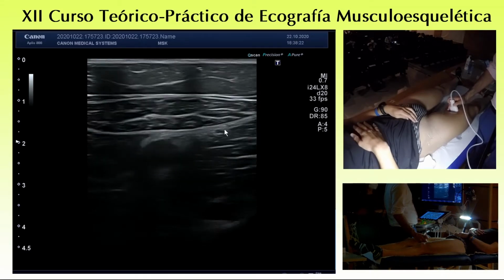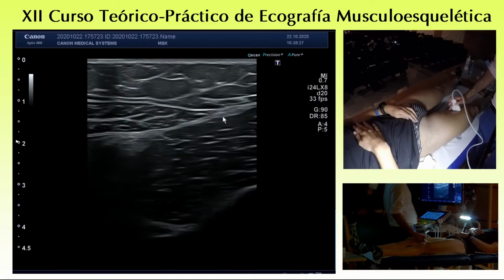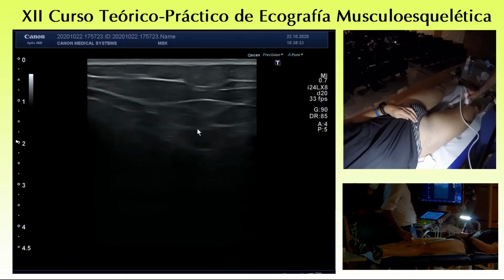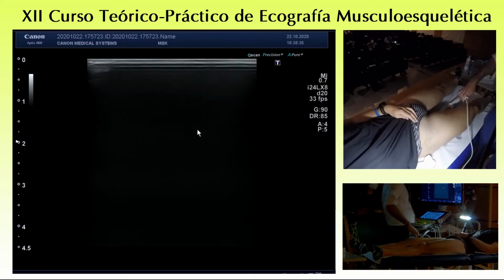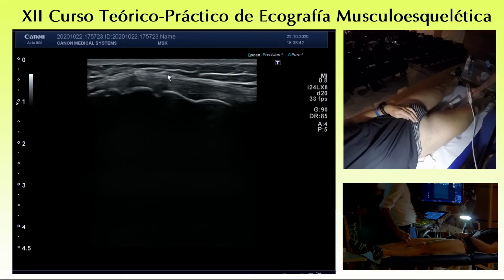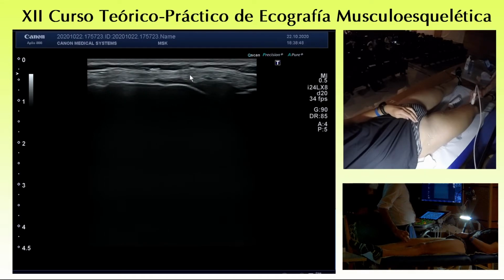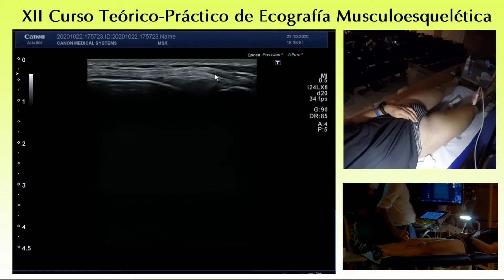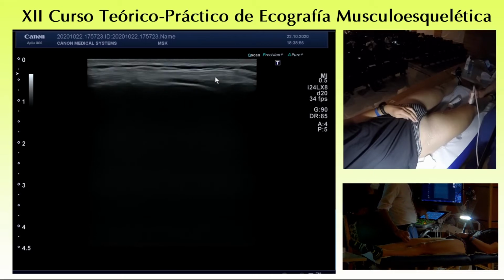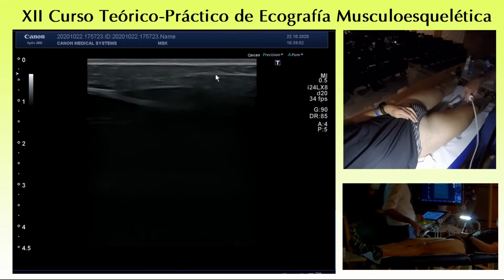but of course it's not easy to follow. The most important thing is to find some landmark, and for this nerve, for the infrapatellar branch that you see here, the main landmark is the medial collateral ligament, because just on the femoral attachment here you find it, and then you follow it up here. You can follow it everywhere to see if there is any scar tissue around it. This is our role. I mean, from the clinical point of view it is really significant. Okay.